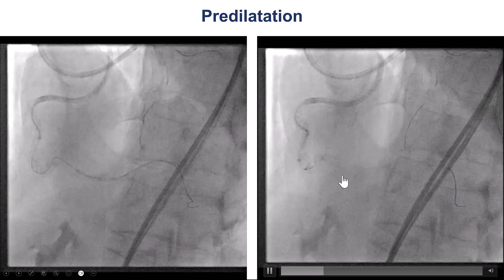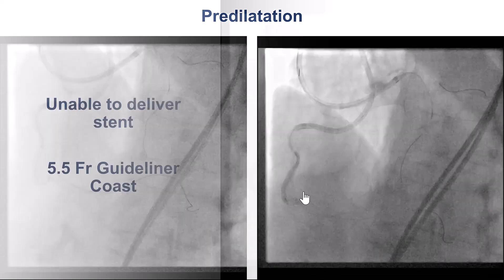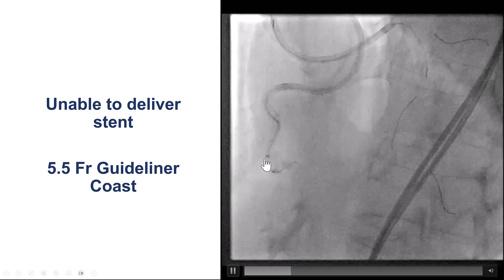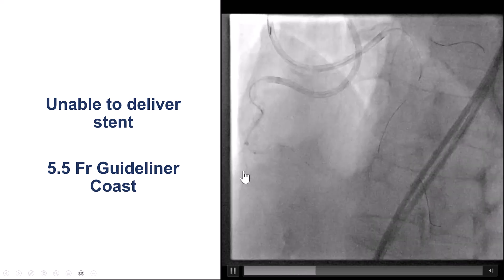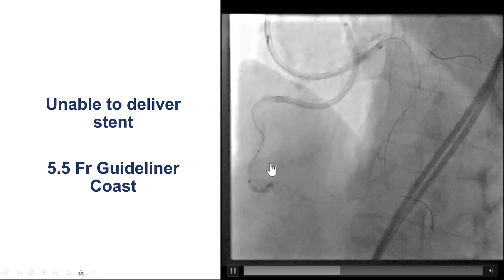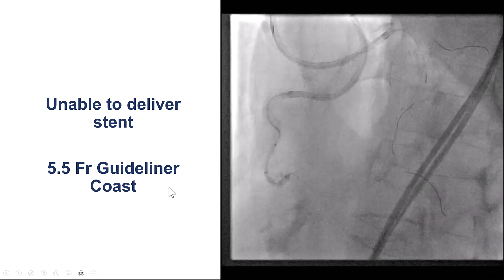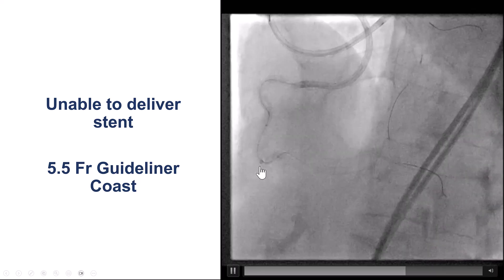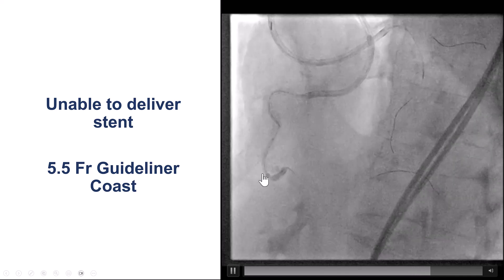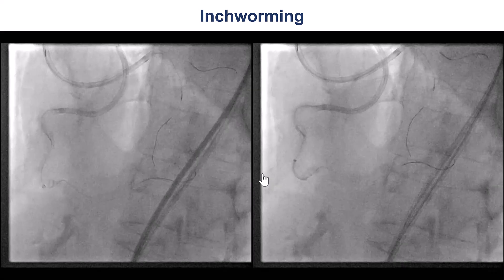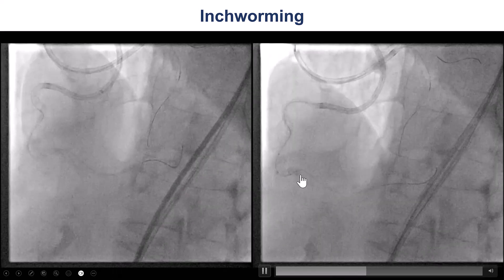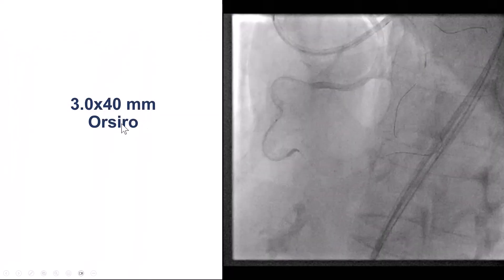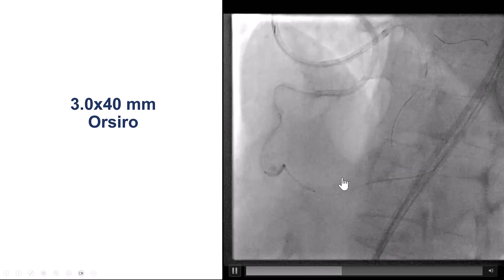After switching to a workhorse guidewire, we pre-dilated the distal right coronary artery and tried to deliver a stent; however, the stent could not be delivered. To overcome this challenge, we got the guide extension as far down as possible by switching the Trapliner for a slightly smaller 5.5 French Guide Liner, which could go all the way down to the RCA at the site of the bend. By doing that, we were able to bring it way distally, and after delivering past the bend, a 3×40 mm thin-strut stent was delivered to the right coronary artery.